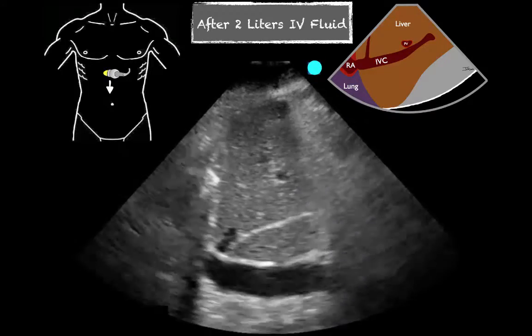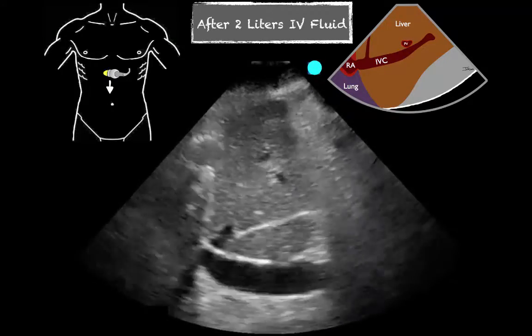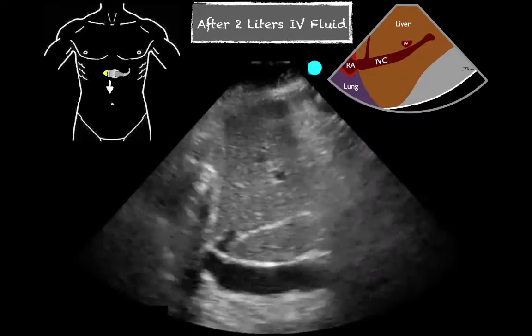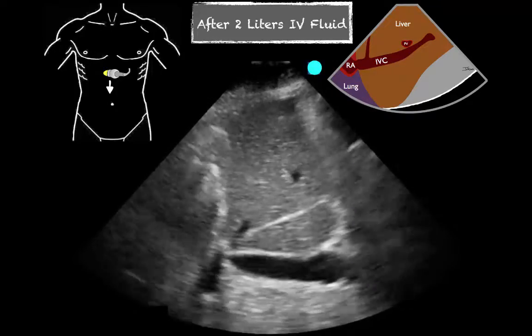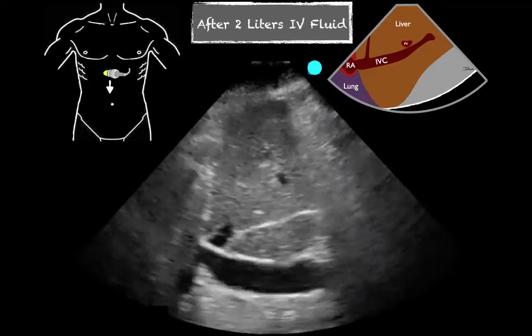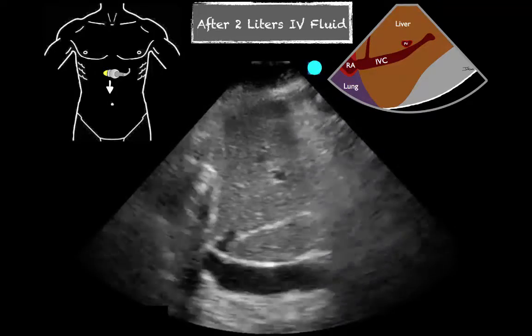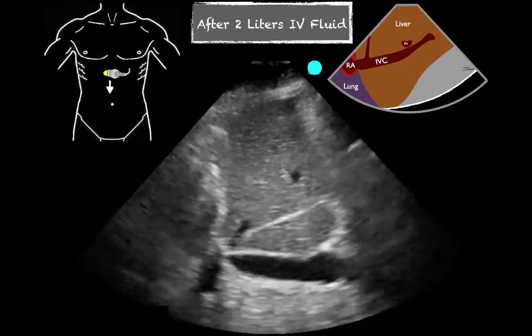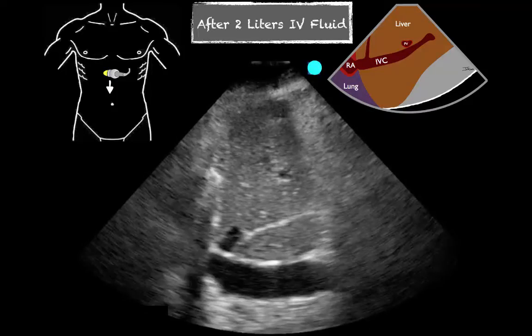And this is what we have after the second liter — even more distended, a little less variation. The patient was doing well and blood pressure improved significantly.